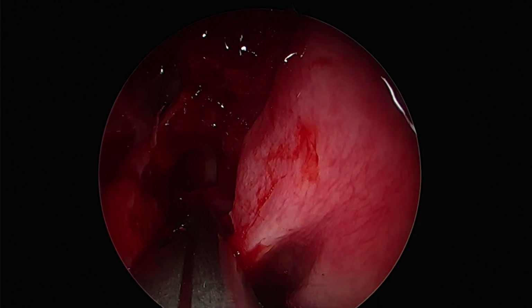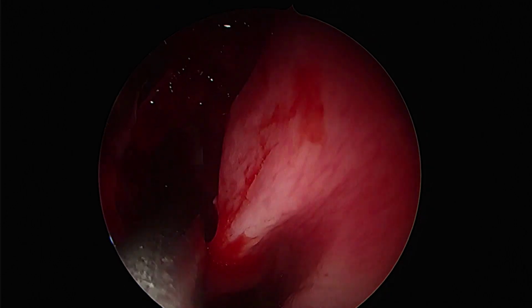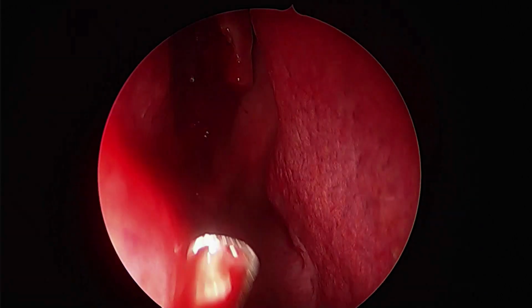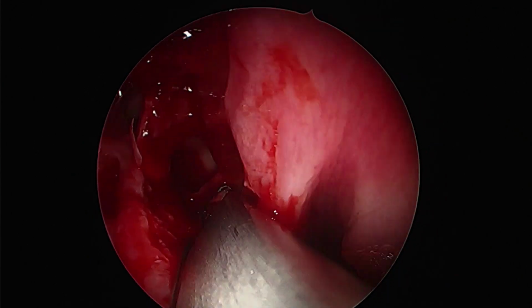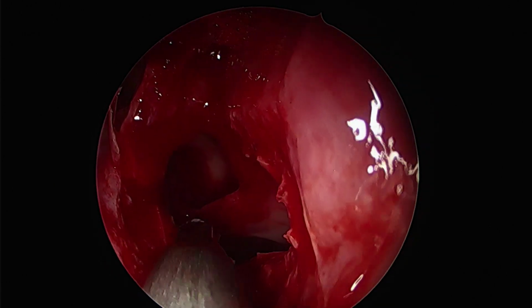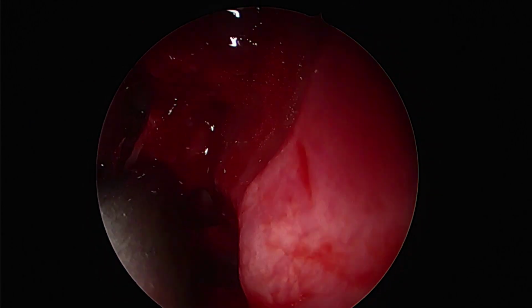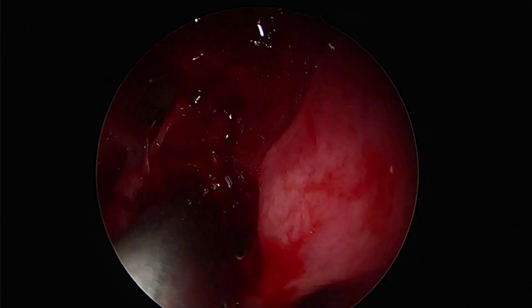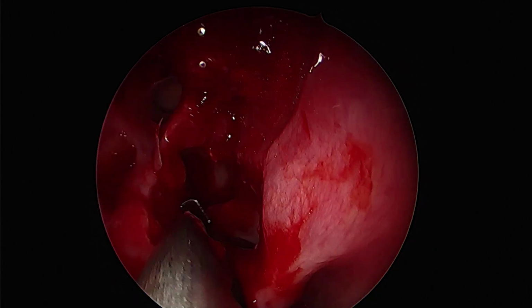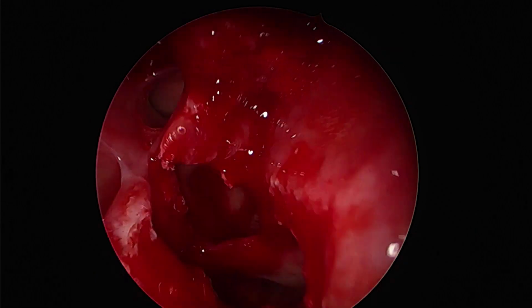Most of the openings we make during surgery will have around a 40 to 50% reduction in the amount of opening after 6 months, and that has to be borne in mind when we create an opening. And since it's a revision surgery, that must also be put into consideration, that we do not want further revisions. So making a large opening into the concerned sinuses, which allows a sufficient amount of fluid for irrigation, is the most important goal of surgery. The same bone punch is used superolaterally to remove the bone between the Onodi as well as the rest of the ethmoid cavity.